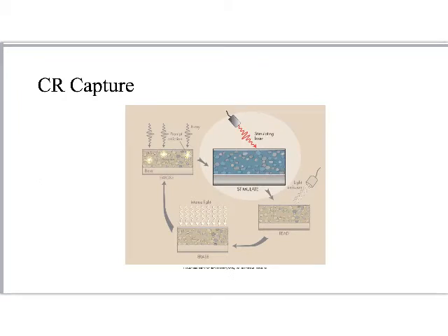So here's what that looks like. I just think this slide's helpful. It comes from Bushong. It's showing a helium neon laser stimulating the europium doped barium fluorobromide. And if you read here, this light emission, I like this slide, in that if you go to a separate part to this, it's giving off a blue light right here. That's actually what's being sampled. That's in the reading part. To erase it, we just expose it to an intense light, typically like a fluorescent light, and then it's ready to be used again.